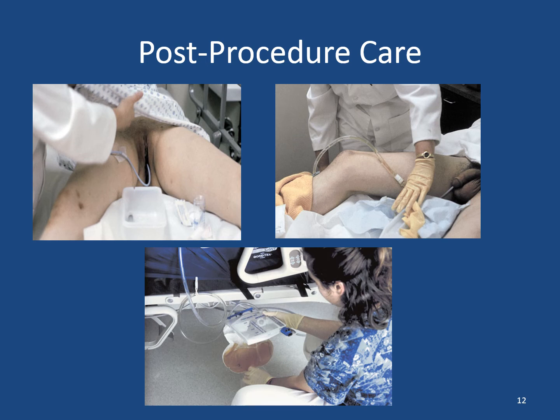So we want to place the bag over the leg, not under it. This avoids kinking and pressure and buildup. We want it to be able to drain freely. So if it's under the leg, it can become occluded. We would want the drainage bag kept below the level of the bladder, but not on the floor, and make sure that the system is kept intact.